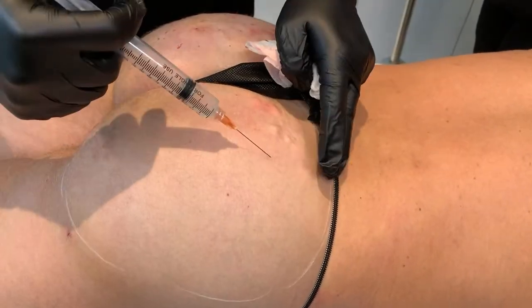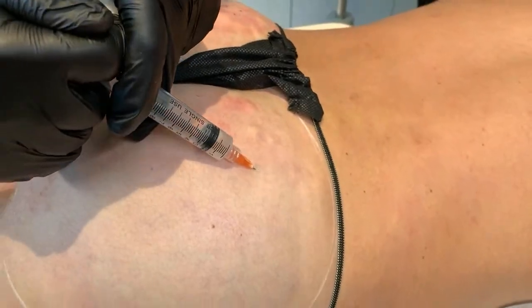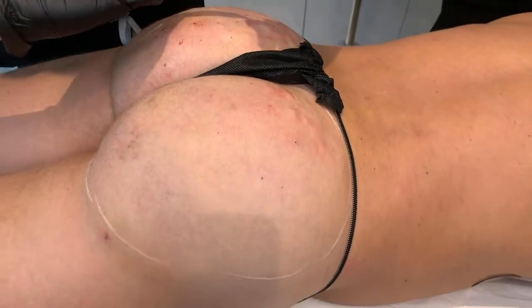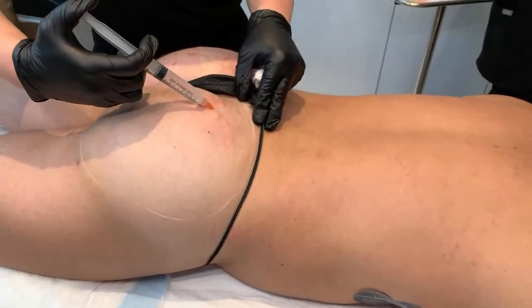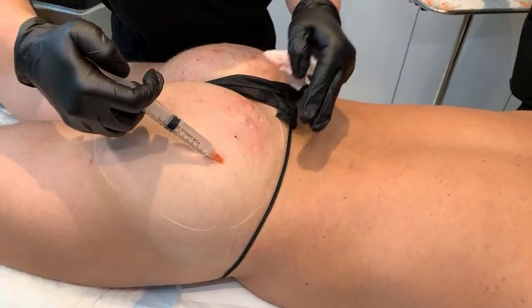So I said, why do you have him squeeze and relax? So that I can see the muscles and do the right shaping. You always want to look at someone in active and passive movement. Squeeze again, relax, perfect. So then we could see the height, where we really want to build, how we want to shape it, etc.